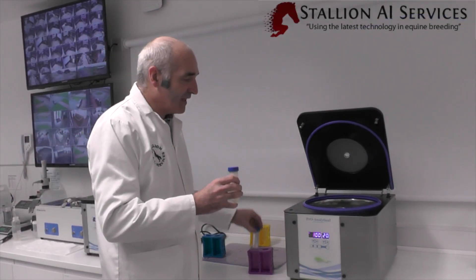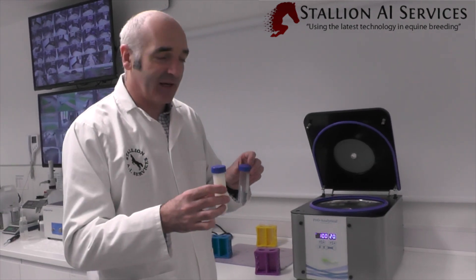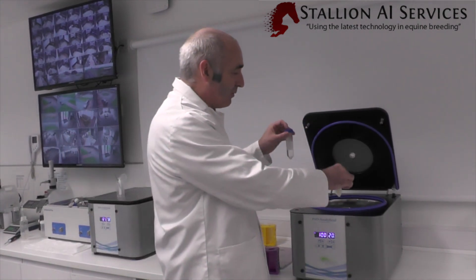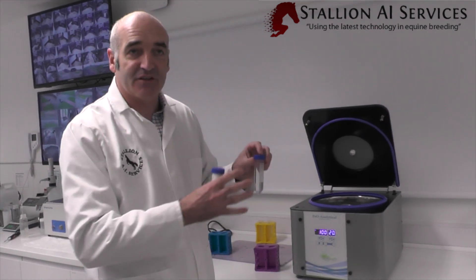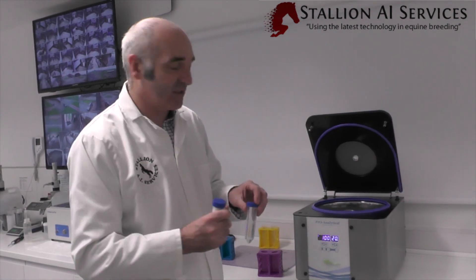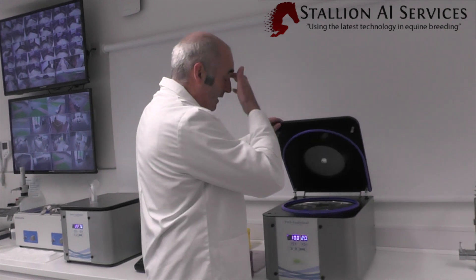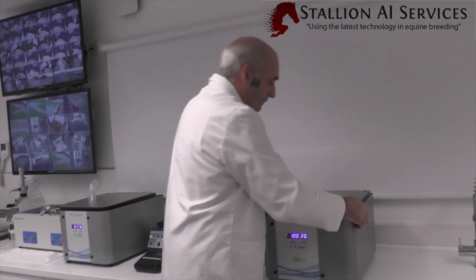Whenever you're loading the centrifuge, always make sure the tubes are properly balanced — that means placing test tubes opposite each other. If they're not balanced you'll get a lot of vibration and it won't work as well. You can actually break a centrifuge this way, so make sure everything is properly calibrated and balanced before you close it up.